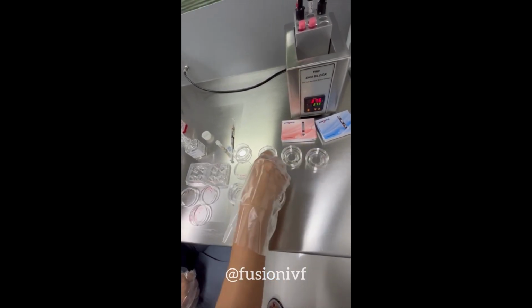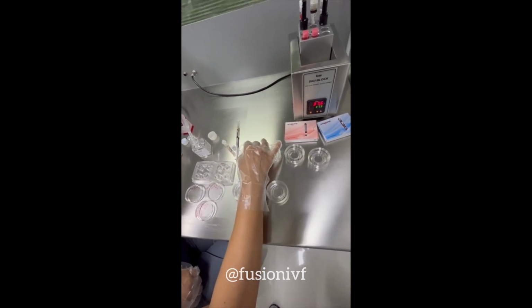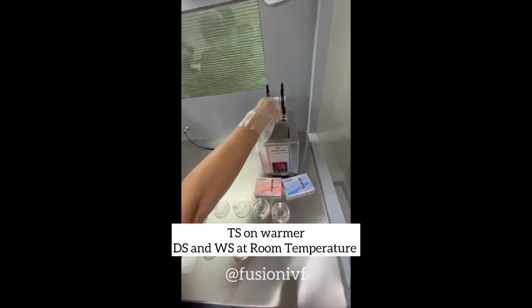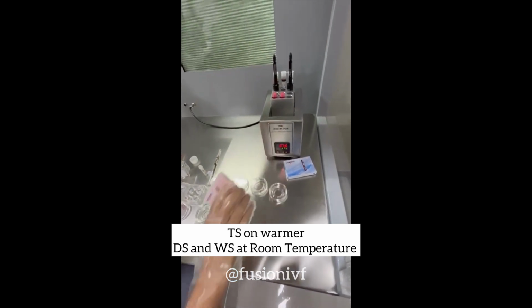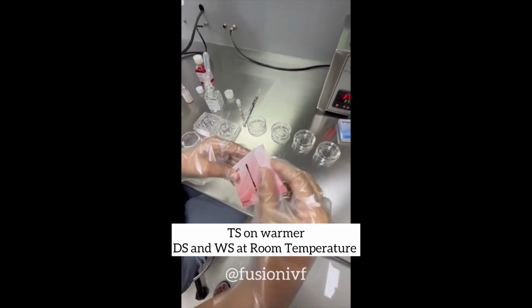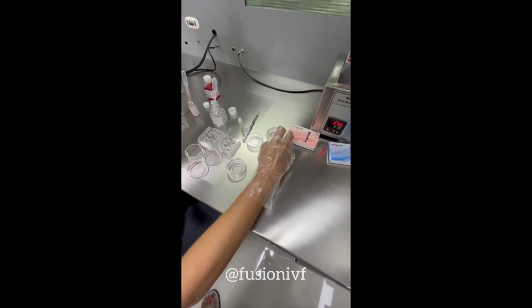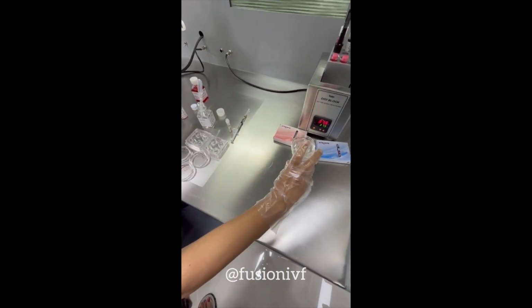which we will be hatching and doing FETs. So we have removed the TS here, both the TS, and then kept the DS and WS at room temperature. And these plates I'll be keeping inside. This is the plates for thawing, so I'll be putting it inside.